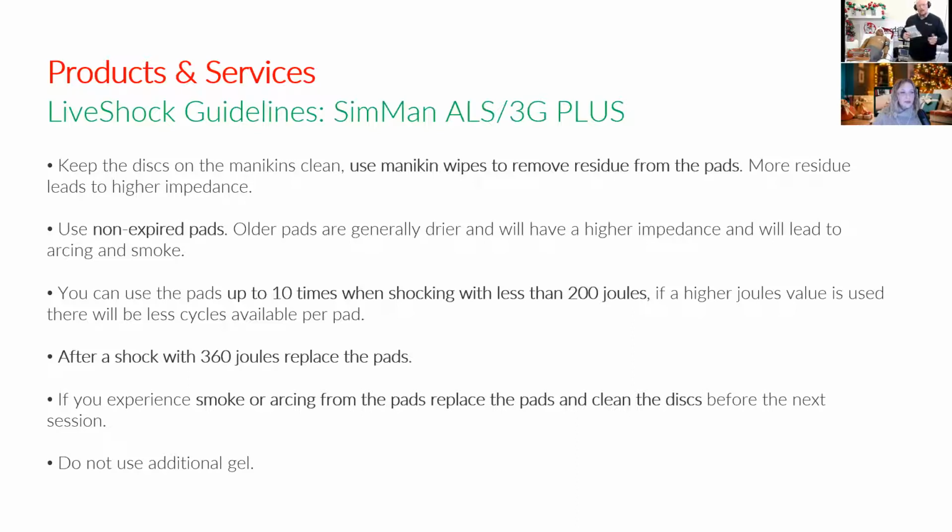Yeah, so I'm going to be using a Physio Control 12 today, and I do have a new pack of pads. Number one thing, they can't be expired. Once they start to expire, that gel becomes very dry, and it starts to cause problems, and we could see some arcing with that problem as well. So these are fresh, they're new. If you start using lightly expired pads and you see smoke or you see arcing, I really think that that's your problem there. But if you're still using new pads, I still got some other solutions.